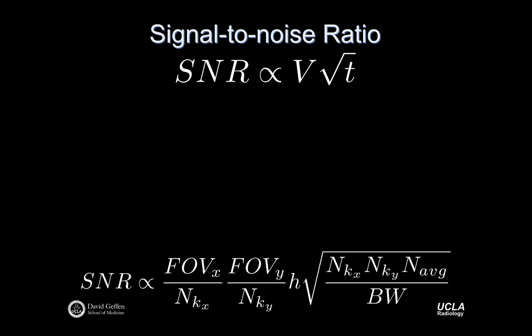We talked about how it's related to signal to noise. What's another image feature that it's related to? Not the transmit RF bandwidth, that is, the RF pulse bandwidth. But for the receiver bandwidth, there was something else it was related to.